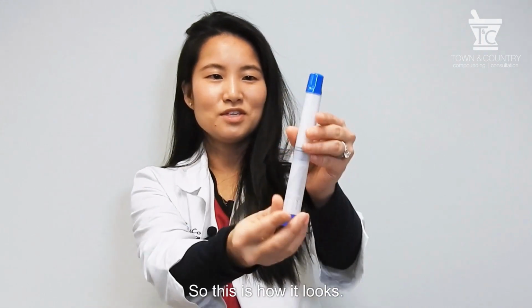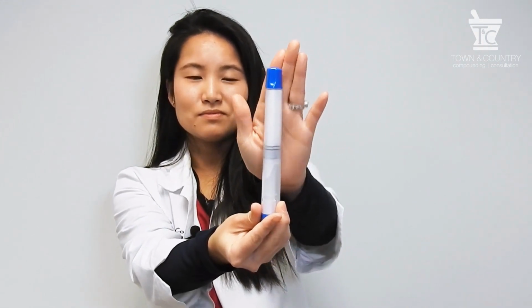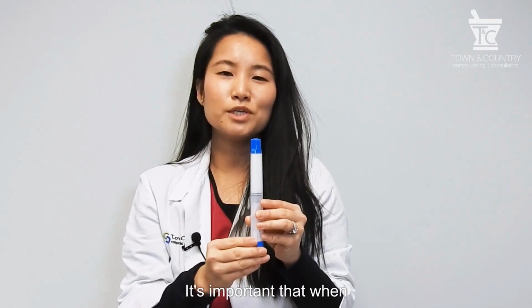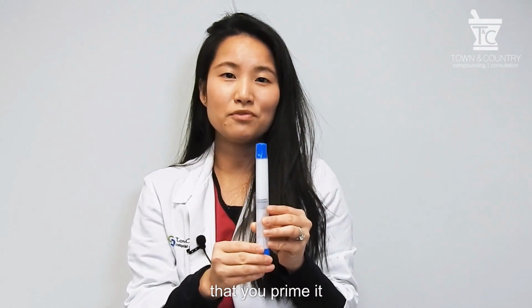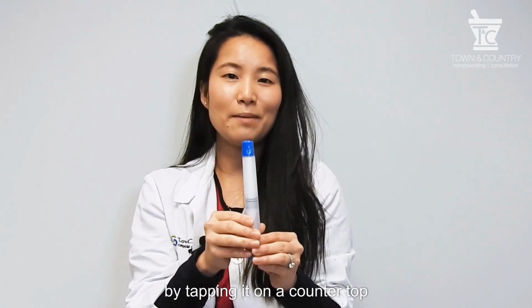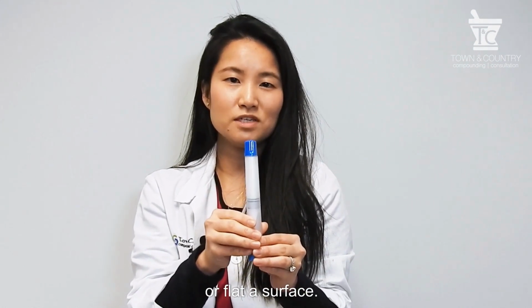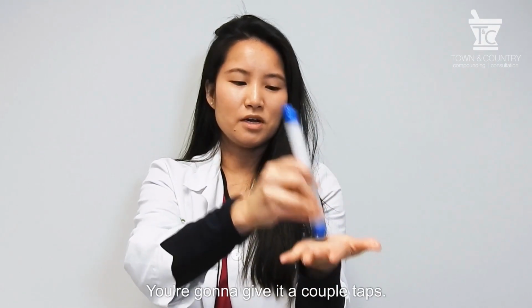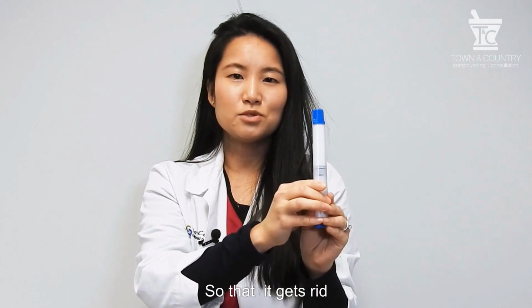In this video, I'll show you how to properly use your Topi-CLICK micro pen. So this is how it looks. It has a cap and a base. It's important when you receive your medication that you prime it before your first application. You can do it by tapping it on a countertop or a flat surface. I'll just show you using my palm. You're going to give it a couple taps so that it gets rid of any air bubbles trapped inside.